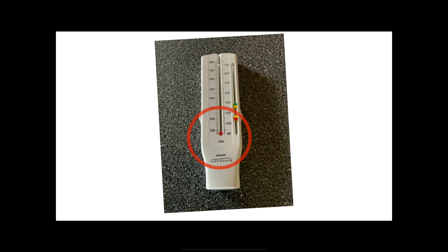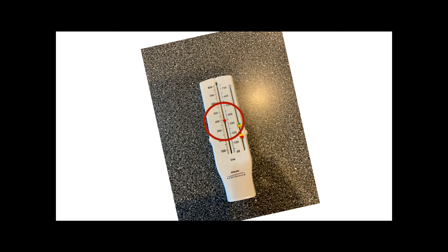Now we're going to demonstrate that. You should stand up — you get more air into your lungs when you stand up. We're going to make it a contest. Big breath in, blow out hard and fast. The little red indicator on here goes up to show how far you went, and then we're going to push that back down because we're going to repeat this three times to get our average.